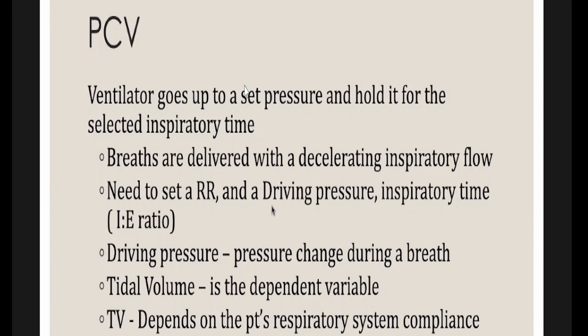So with inspiratory time, which is known as an I:E ratio, the inspiratory to expiratory ratio should be there. Based on that, the ventilator will go on delivering the pressure based on the pressure target. So the driving pressure is the pressure that changes during a breath. Okay, so during a breath, this driving pressure can change.